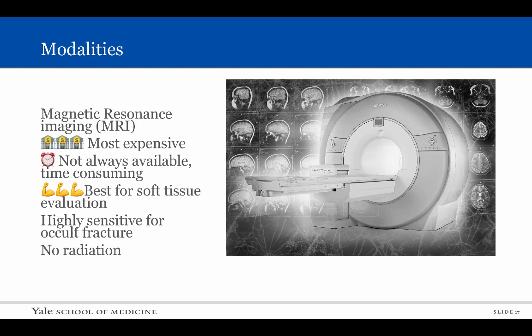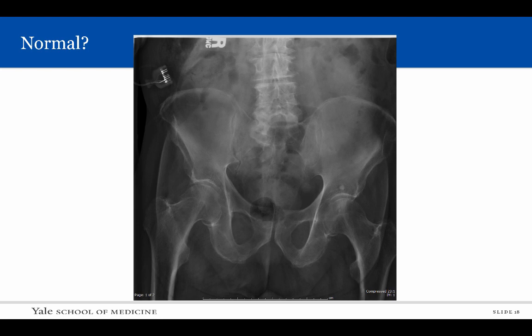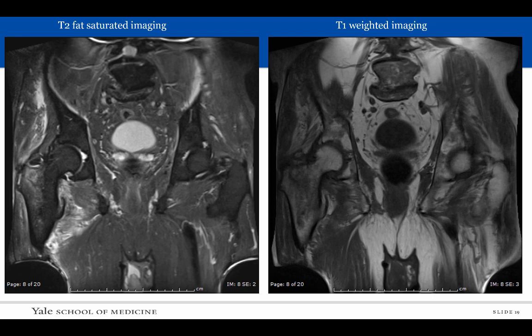Magnetic resonance imaging is another common tool that we use. MRI is expensive and is not always available at all institutions at all times. The time to perform exams can range from 15 minutes to over an hour. MRI is the best examination to evaluate soft tissue structures and is highly sensitive to evaluate for occult fracture. Additionally, there is no radiation with MRI. This elderly patient presented to the emergency department with right hip pain. The initial plain radiograph demonstrated no evidence for displaced fracture. An MRI was obtained which showed bone marrow edema in the region of the right greater trochanter with surrounding muscular edema. There was a corresponding low T1 signal line within the greater trochanter on the right which represents the occult fracture line.